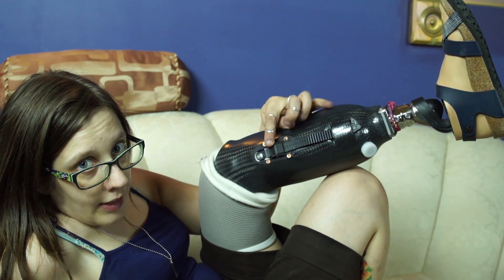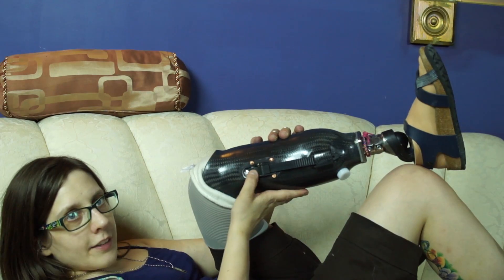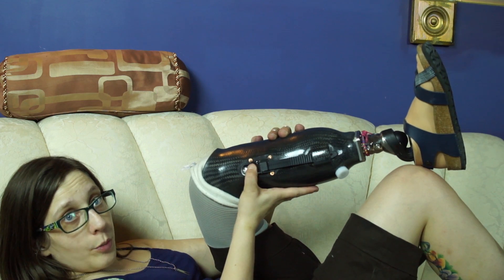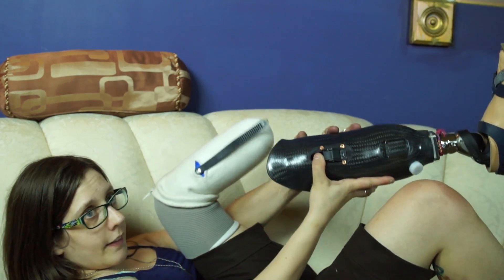This ratchet you see here is part of a lock system called a proximal lock, which is made by Coyote. To take my leg off, I press this latch, which releases the ratchet strap, and then my leg comes off like this.